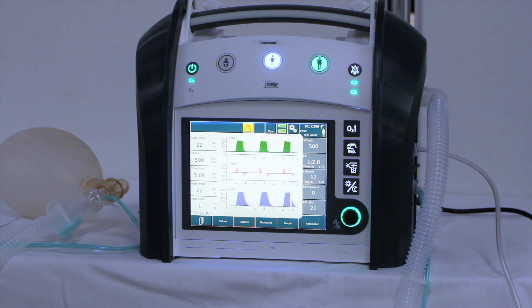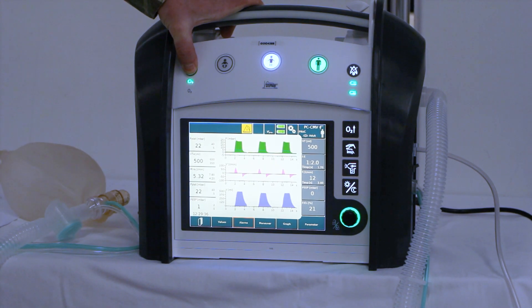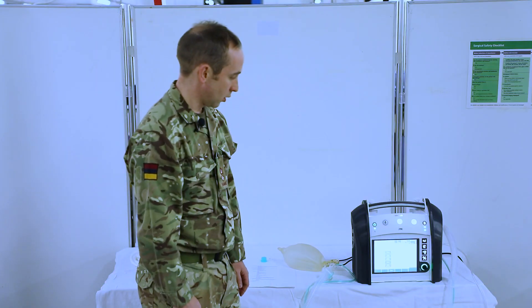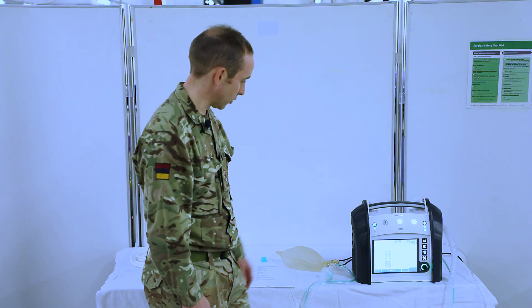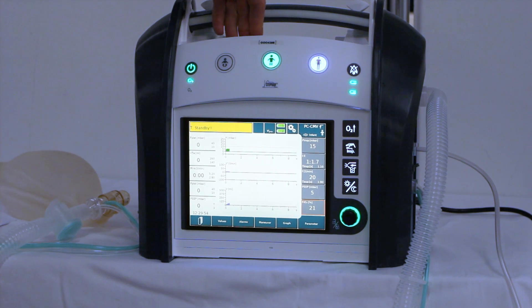Once those tests are complete, we're going to put it in standby mode. Press and hold the power button until the blue menu appears — this will say standby, confirm, or cancel. Click confirm. We're now in standby mode. We're just going to check the pediatric mode, so press the pediatric fast start button, press and hold until it flashes green, and then press and hold to confirm.